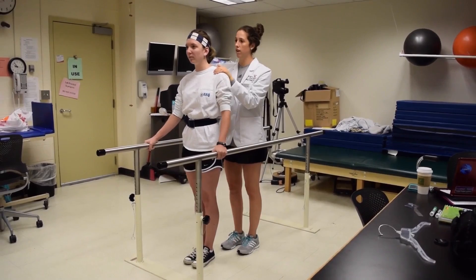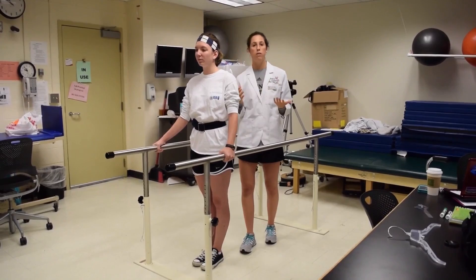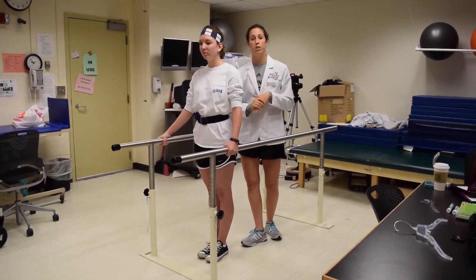Great, how'd that feel? Good. So those are the activities we're going to start with today on the parallel bars. Courtney felt safe doing everything that she did and her gait pattern looked good. When working with these activities, we always want to be sure to ask our patient what their functional need is going to be once we are finished with therapy, because we want to send them home prepared to safely do all of the activities they will be doing in their day-to-day lives.